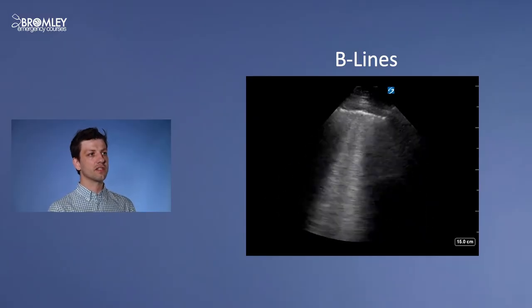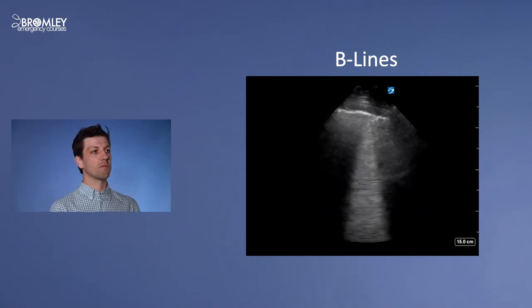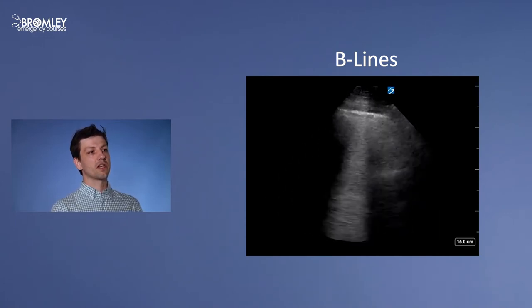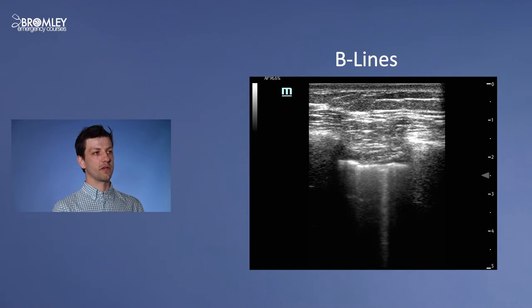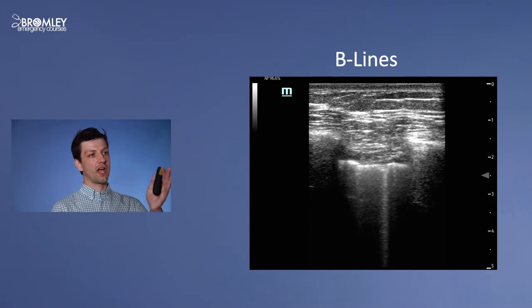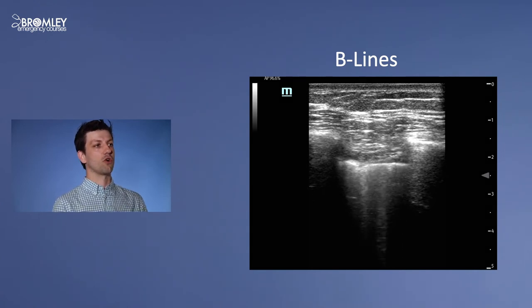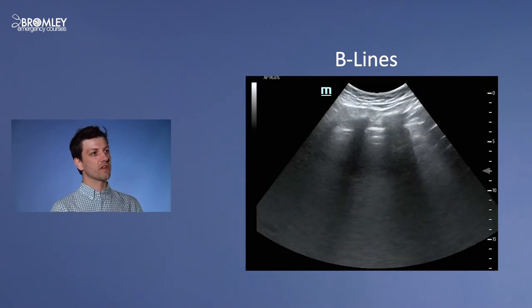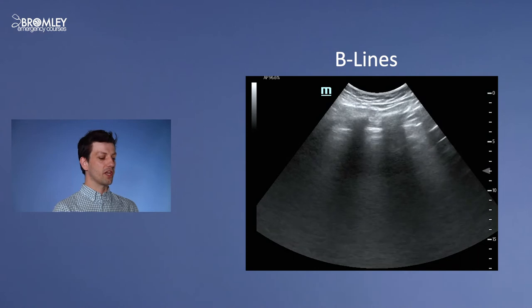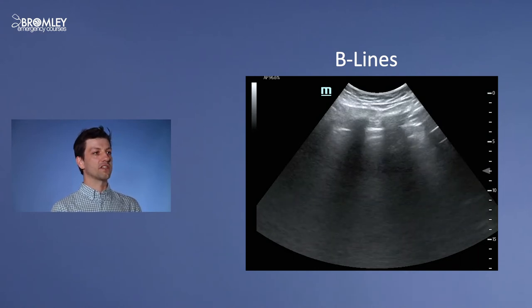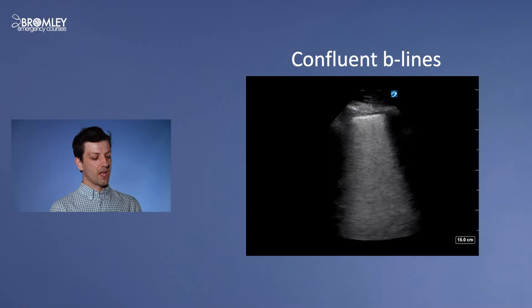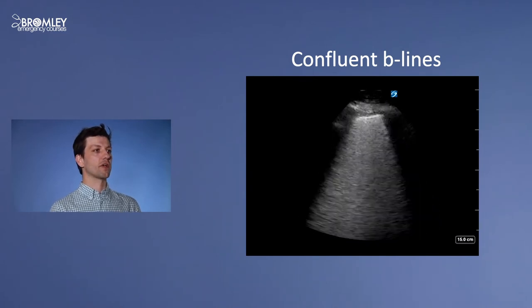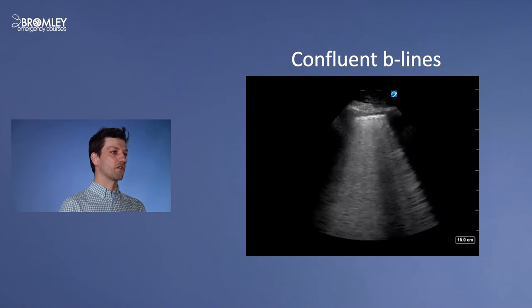Here we see B lines with an irregular pleural line, likely infective. In the linear image, B lines emanate from the pleural line and extend all the way down the image — very different to the comet tail artefact. Here is another video taken with a curvilinear probe showing three rib spaces, with B lines again emanating all the way through the entire depth of the image. In severe interstitial syndrome, the B lines become confluent, as shown in this video.